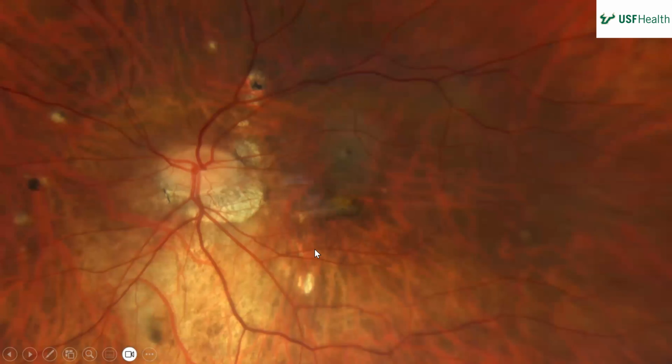Then in the left eye, you can see a little bit more spots, similar to the ones she had before, but it looks more nasal there too. Yeah, it's challenging. And then this area here, it looks like the grayish white lesion maybe spread superiorly as well. And then I think that pigmented spot is neat too. How is this not peripapillary? Well, there's not really peripapillary fibrosis. Okay.